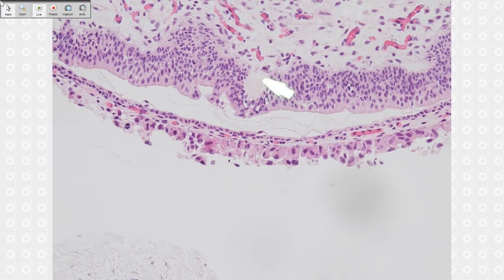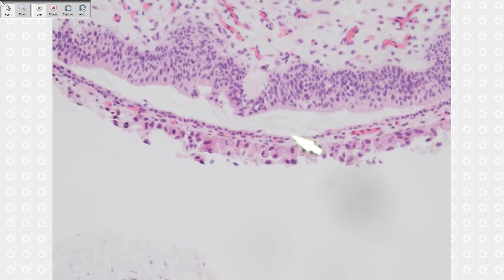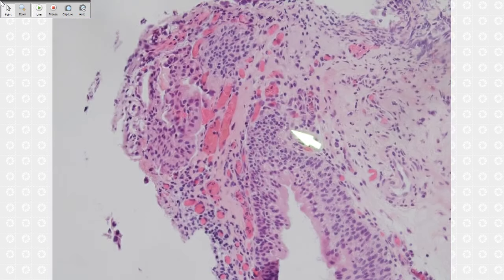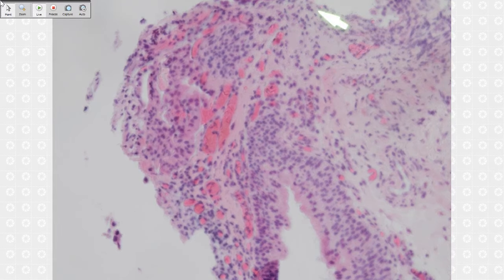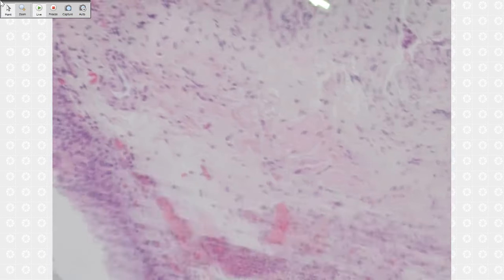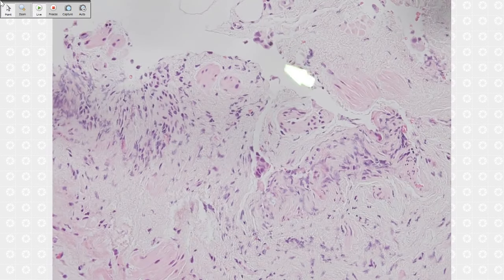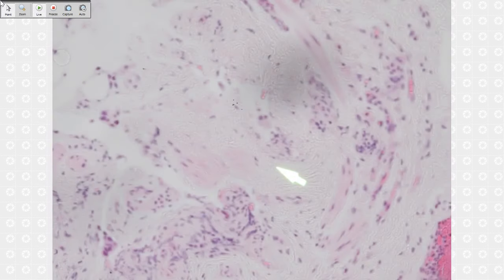Usually if you find a lymphocyte in the stroma, you compare, and if the nuclei are 3 or 4, even 5 times larger than the lymphocyte, that is an in situ flat lesion, right? So if you move back here, a little bit of urothelial carcinoma in situ here. Are those invasive already? No. I think these are just tangential cuts, or invasive, I don't know. Could be tangential cut here. These few cells don't look ugly either. So this one kind of skips, maybe denuded. I have no idea what this is.